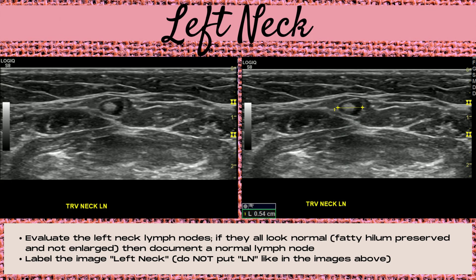Moving on to the transverse left neck — evaluate the left neck lymph nodes, and if they all look normal, meaning the fatty hilum is preserved and there's not a thickened outer cortex, document one of the largest normal lymph nodes. Label the image 'left neck' — do not put 'lymph node.' The measurements you take will depend on your site's protocol. Some sites measure in all three dimensions, some care mostly about the AP dimension, and others about the length. The most common is either all three measurements or the AP measurement.